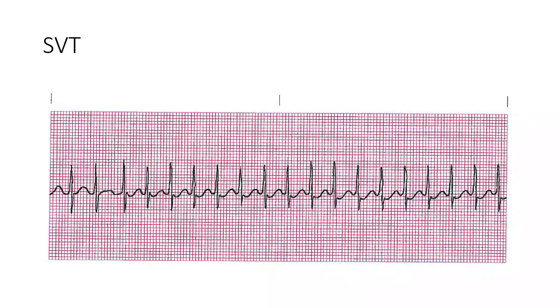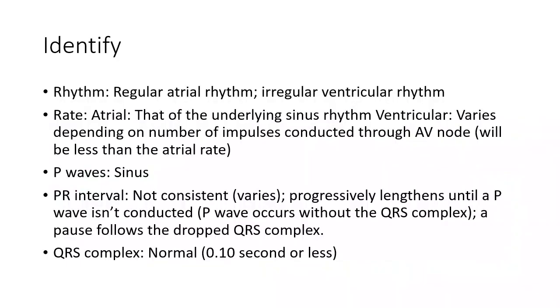Good commentary. Juju, this one's yours, okay? And you'll see some like this where it's not the rhythm, but it's the rules.